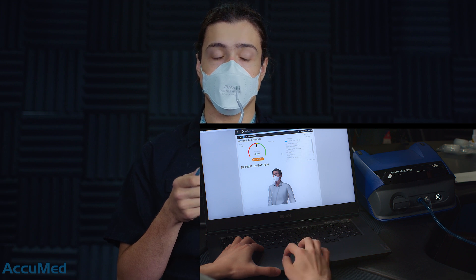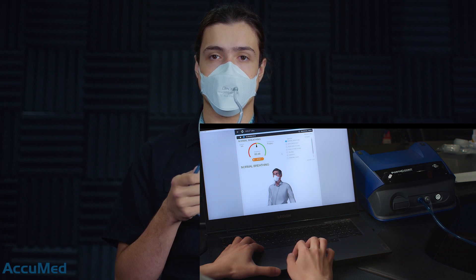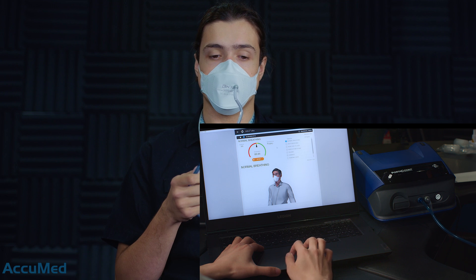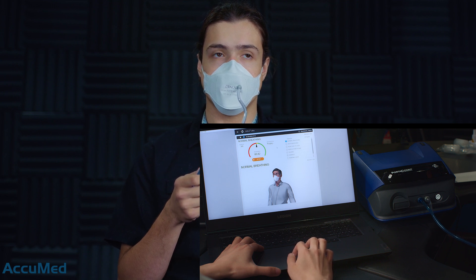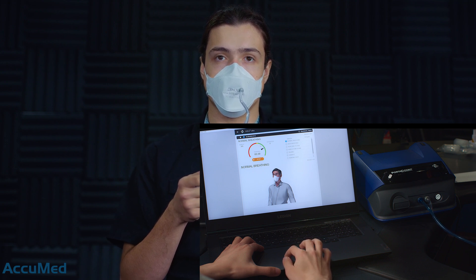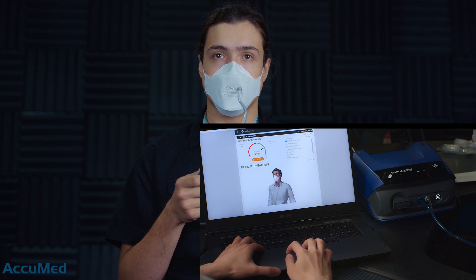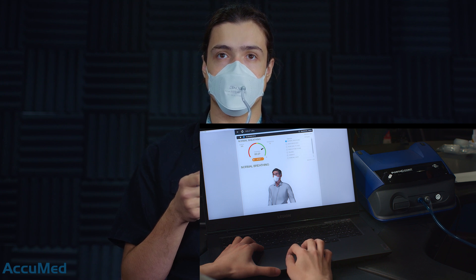Normal breathing. Now the indicator is in the green section, meaning that at the current moment the fit factor is going to be a really good one — probably more than a hundred.